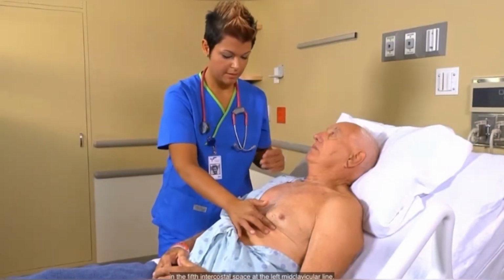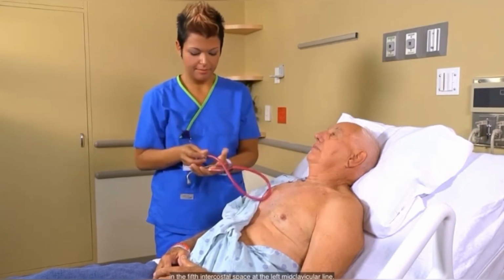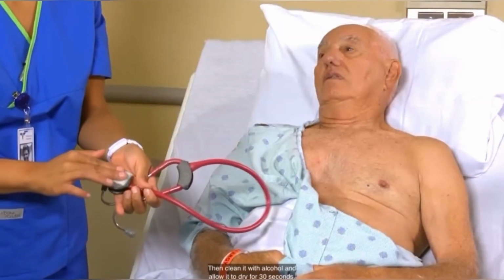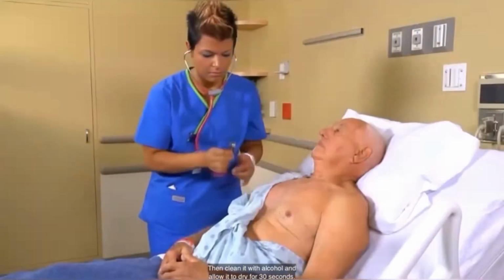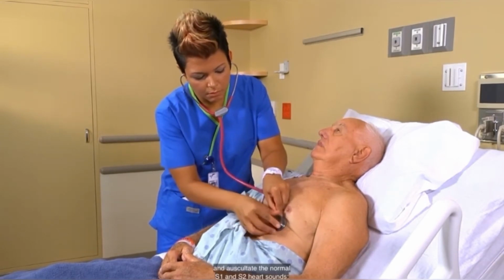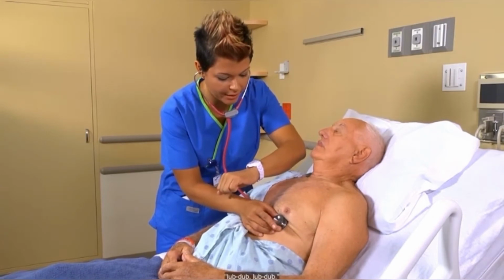Okay, now that I've found the spot, I'm going to go ahead and take a listen with my stethoscope here, okay? Next, warm the diaphragm of the stethoscope in the palm of your hand for 5 to 10 seconds. Then, clean it with alcohol and allow it to dry for 30 seconds. Place the warmed diaphragm of the stethoscope over the PMI and auscultate the normal S1 and S2 heart sounds, lub-dub, lub-dub.